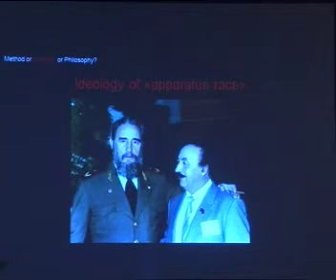Another big problem is the ideology of the apparatus race, because a lot of people, after and during the introduction of the Ilizarov method, produced their own frames, and they used to say that my frame is the best, the Ilizarov frame is not as good as mine. It's quite popular, and all these people were fighting each other for the best frame. I think it's very silly to fight for the frames, because all these things are based on one thing.